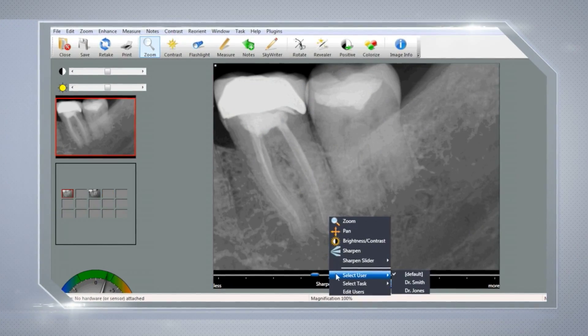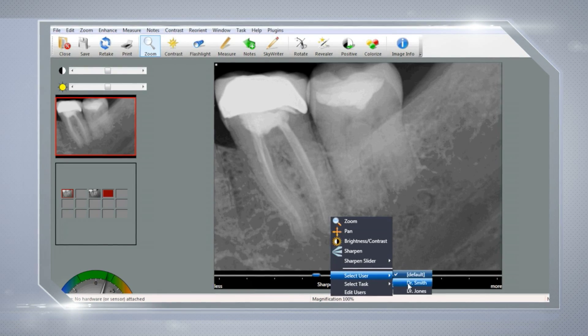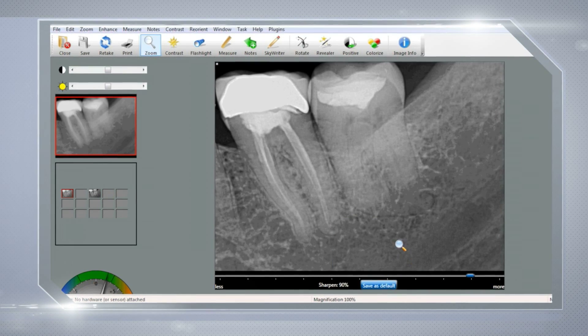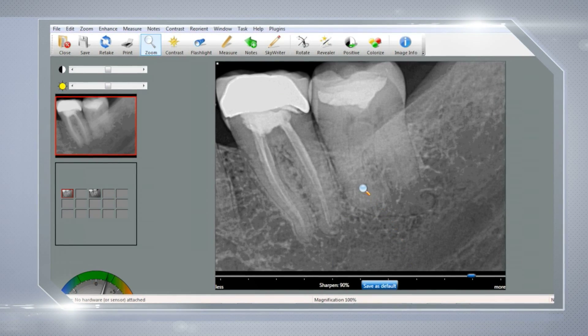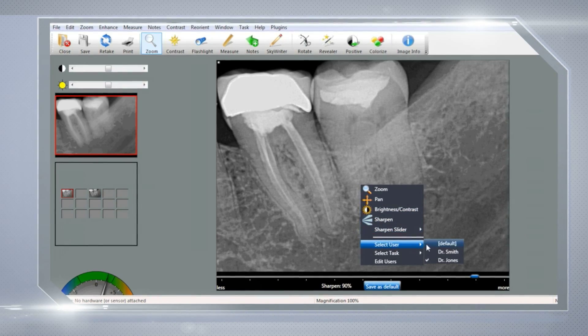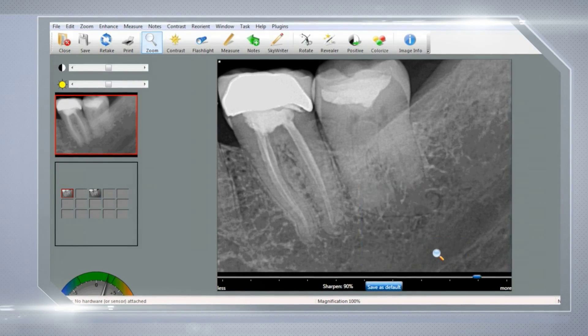Schick 33's supporting software allows the creation of customized presets or MESETs that allow each clinician to automatically capture their images in their preferred appearance, ensuring swift image capture as well as ease of use and flexibility in multi-doctor practices.